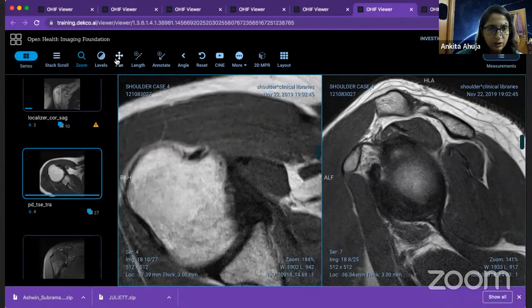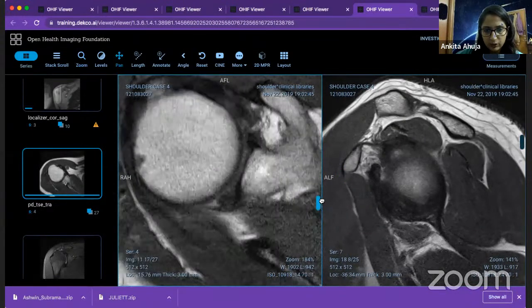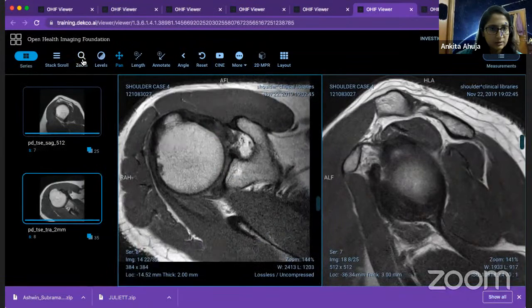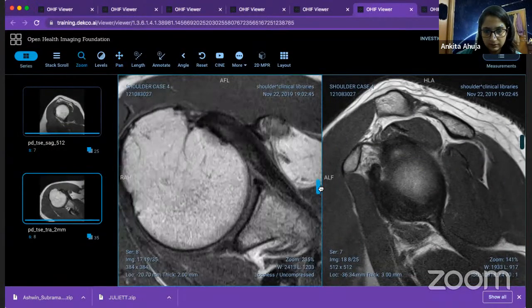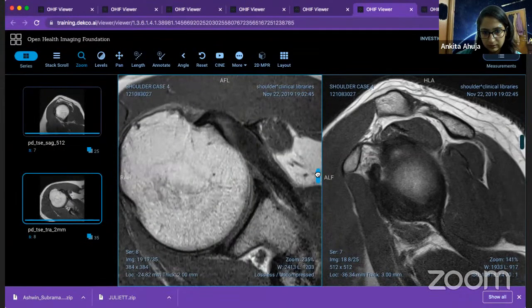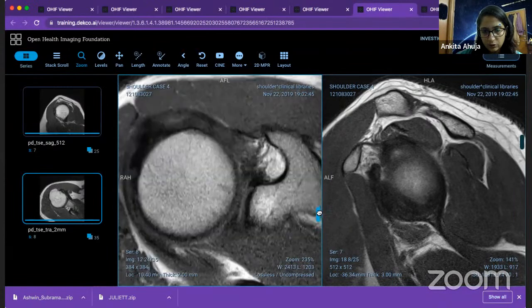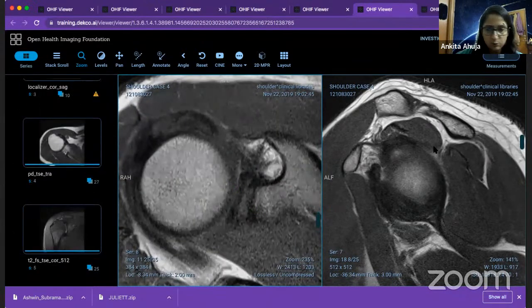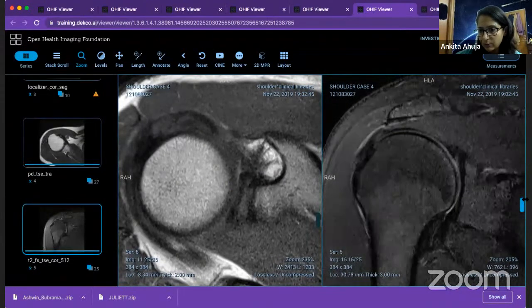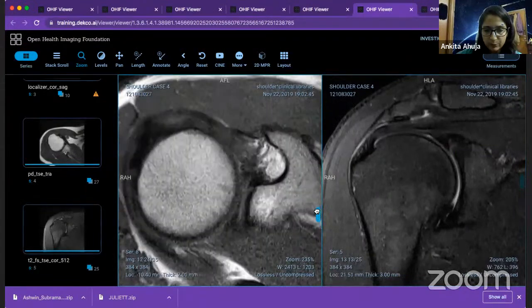Now moving on to the articular cartilage and labrum quickly. You guys have to answer, looking normal or abnormal. I'm just scrolling. This has a little motion. Let's choose the other one. What do you guys think? I'll tell you, I'm in the superior most section, and the superior most section we saw over here as well, the superior labrum, like I had discussed last time. So I'm able to see the superior quadrant labrum over here as well. And now I'm showing you the anterior and posterior labrum over here.